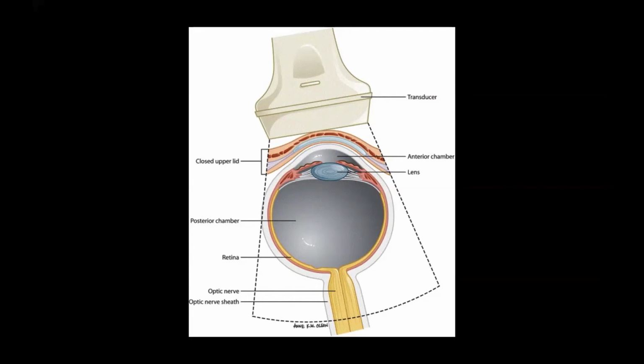So if you're struggling to see through that, you may have a little bit of extra success if you slide right off the cornea and go just a little bit below the limbus if you're in transverse. You may get an easier and more direct view into the vitreous body. But that being said, we're typically going to go over the cornea in the sagittal or upright orientation or the transverse or horizontal orientation, right?